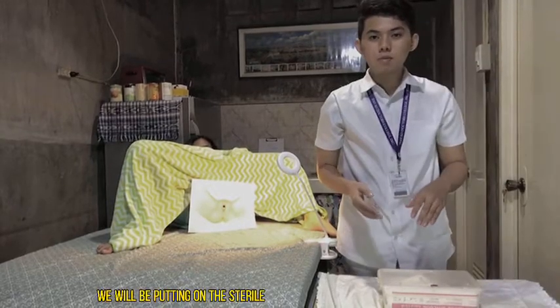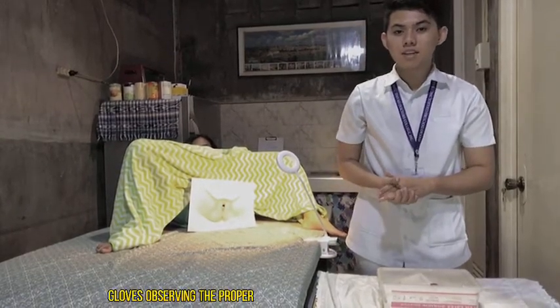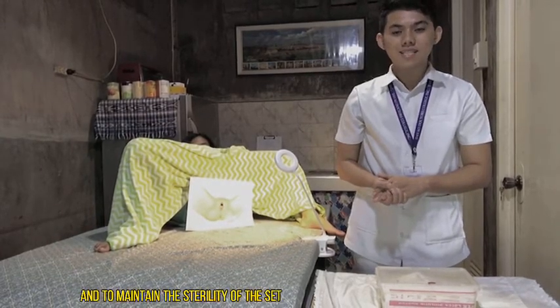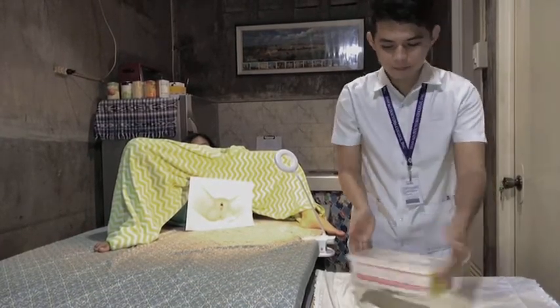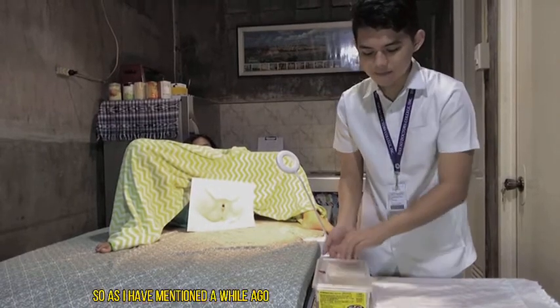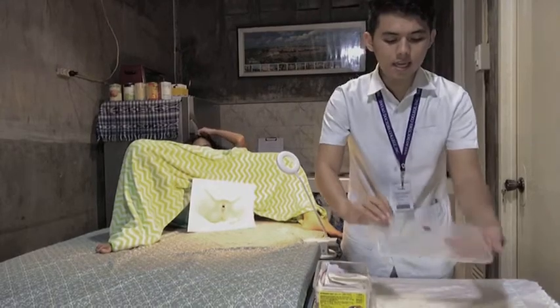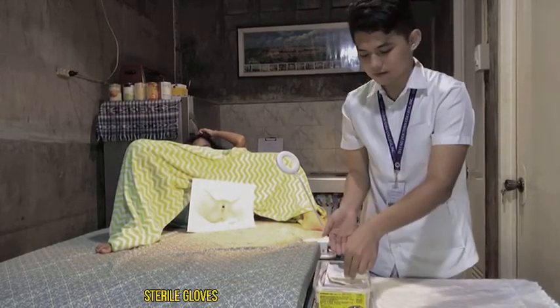So now we will be putting on the sterile gloves, observing the proper technique for us to prevent contamination and to maintain the sterility of the sets. So as I have mentioned a while ago, this is a sterile package composed of sterile gloves.